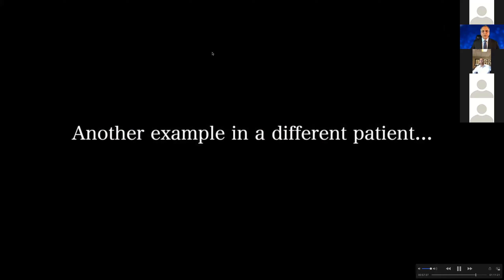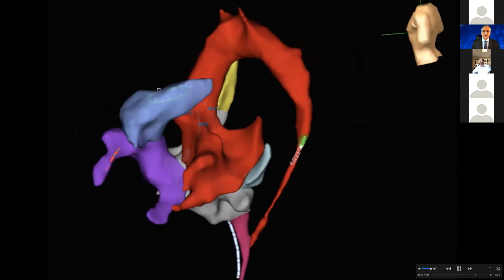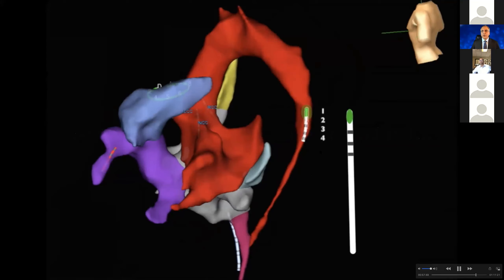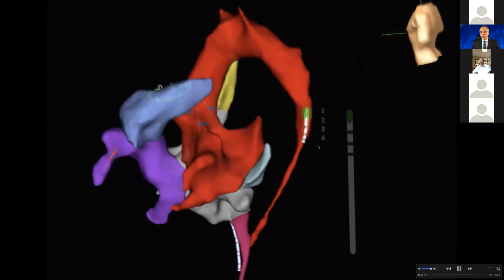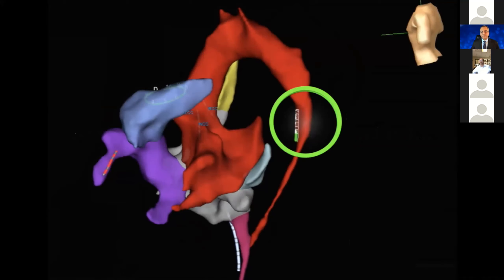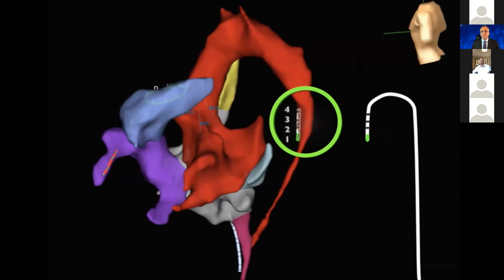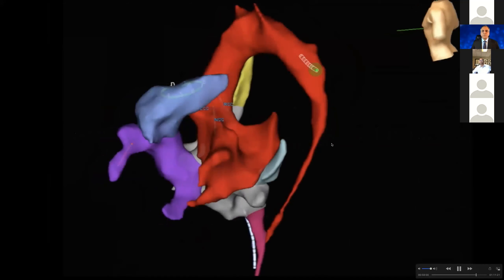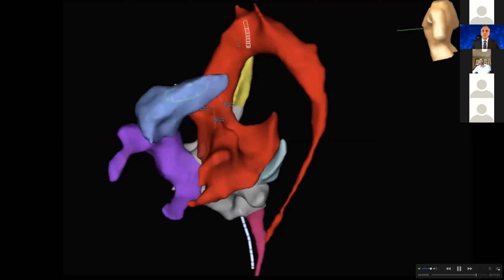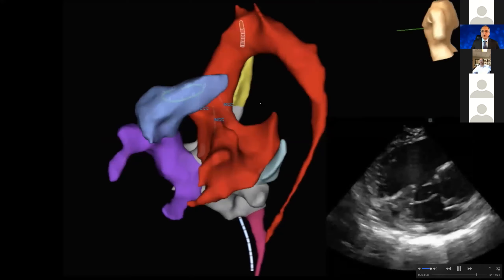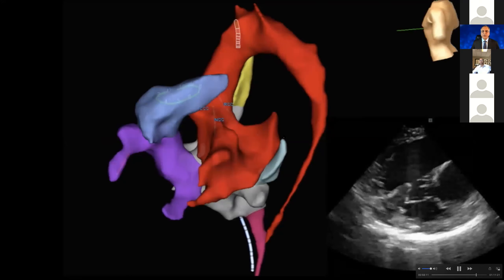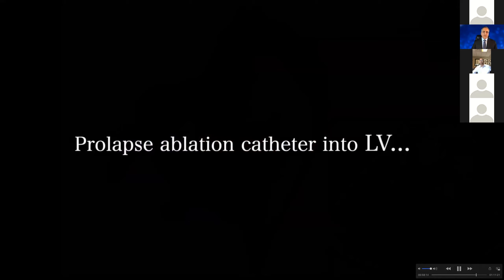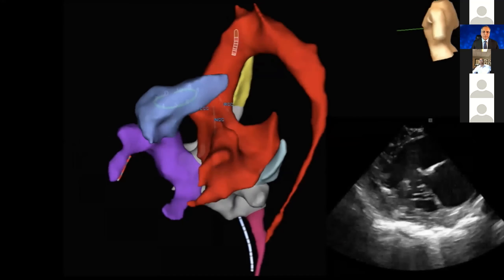So another example in a different patient — again, you can see that the ablation catheter is going up and you're going to be able to perform the U-curve here. As I advance this, you can see it coming towards the ascending aorta, and through your ICE image you can see this catheter advance and prolapse through the aortic valve into the left ventricle.